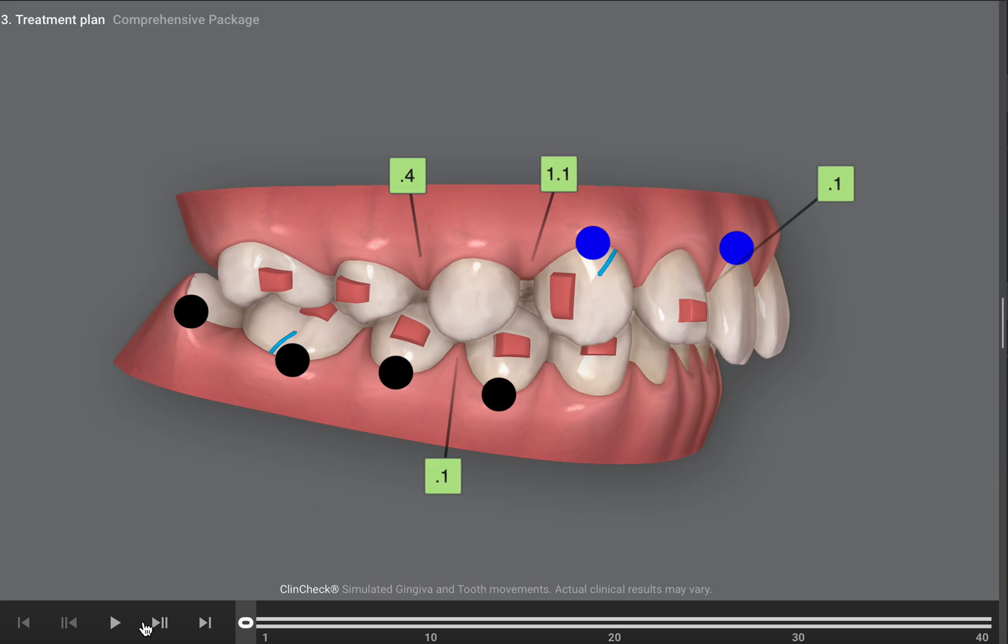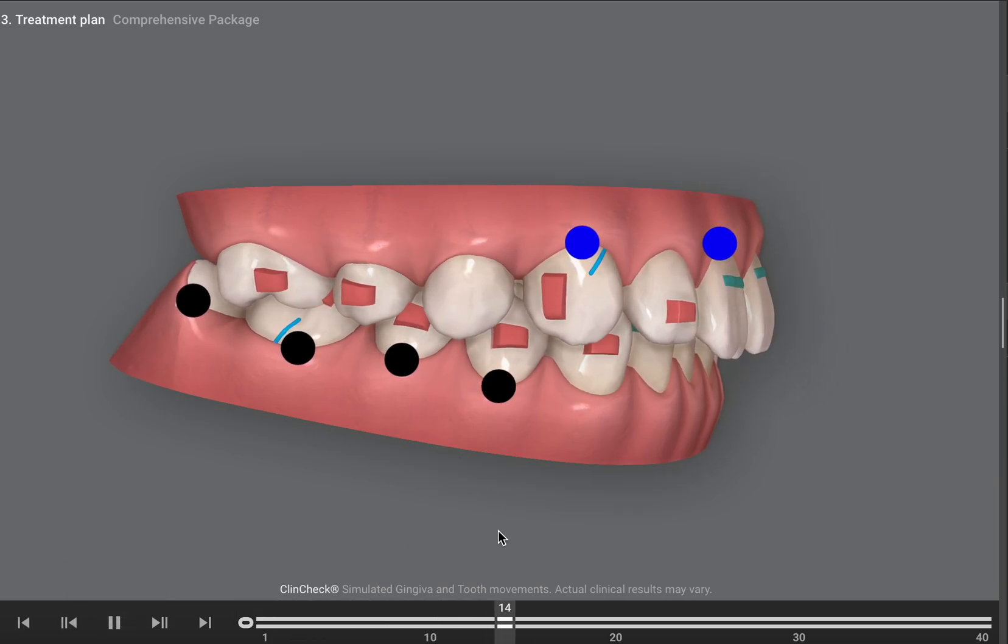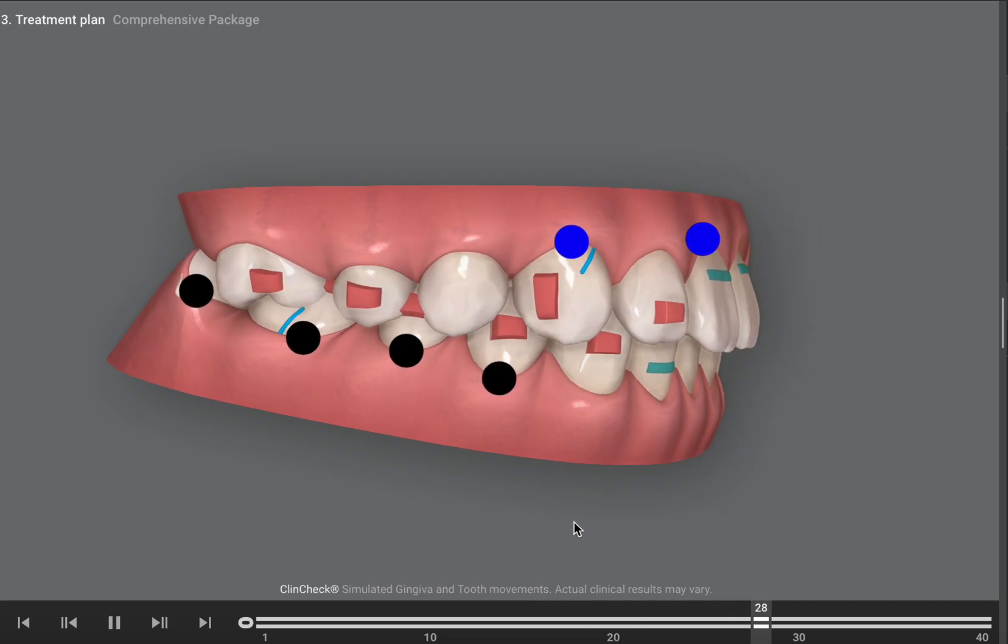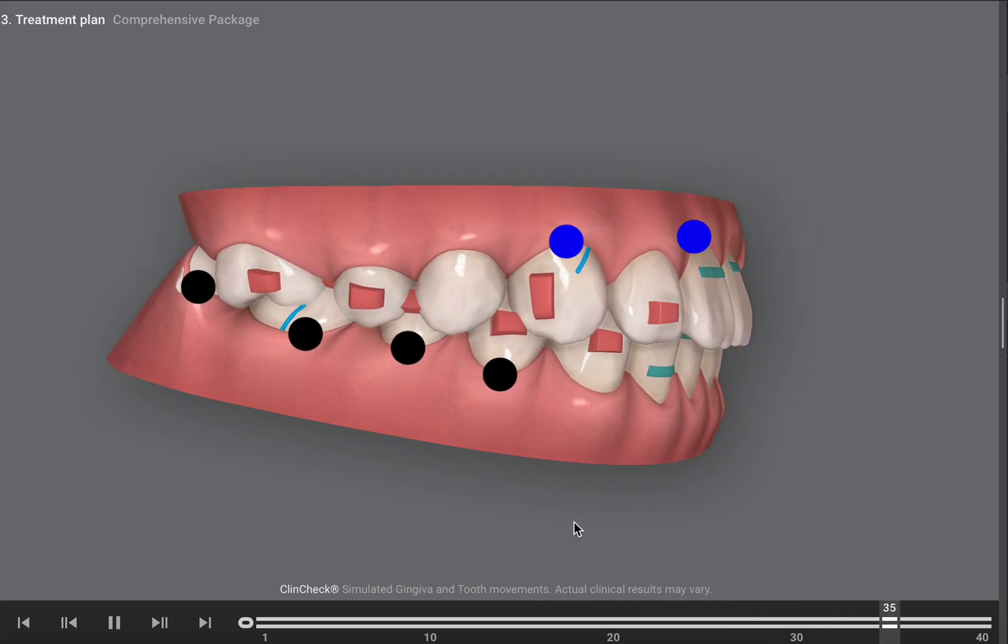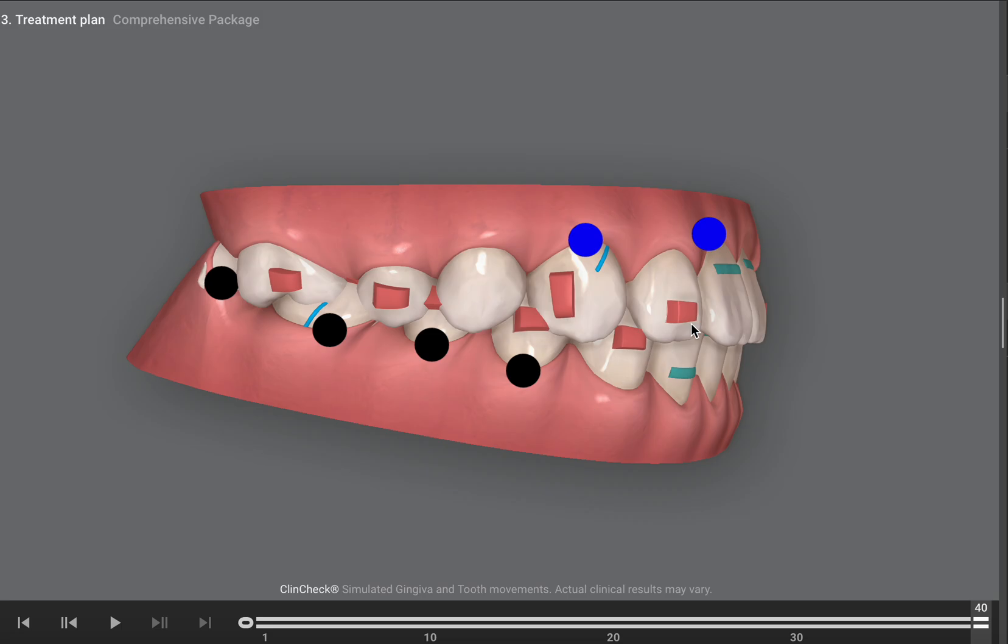One other thing is aligners are very good at incisor retraction. So if you don't watch your incisor angulation at the end, you will get some sort of retraction. So you have to really build in what we call lingual or palatal root torque. If you see the incisor angulation here, it is fantastic. This is how I want to finish a lot of my ideal class one cases.